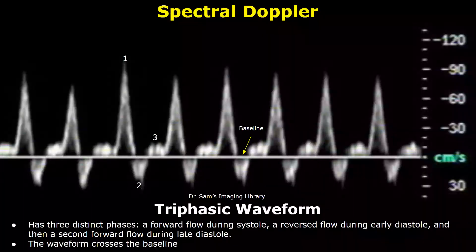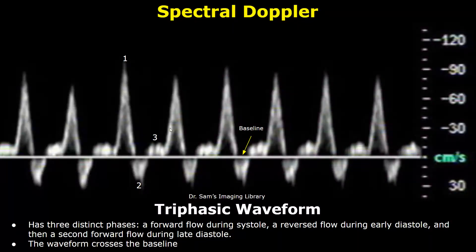In a triphasic waveform you will find three distinct components. The first component will be forward flow during systole, then a reversed flow during early diastole will be the second component, and the third component will be the forward flow during late diastole. So we see three components, therefore it is a triphasic waveform.